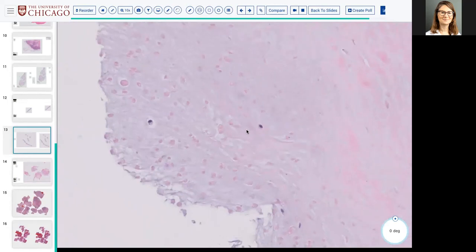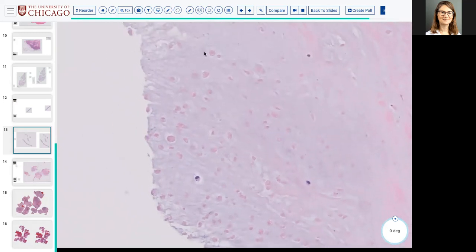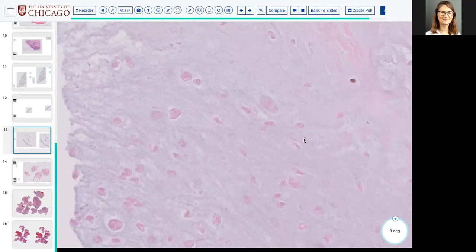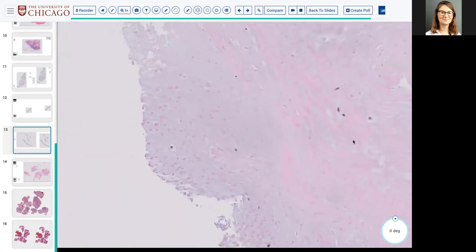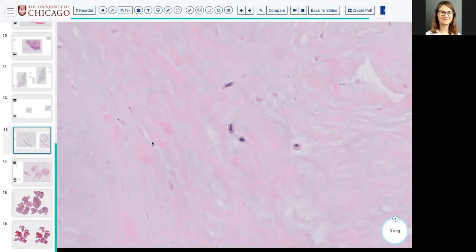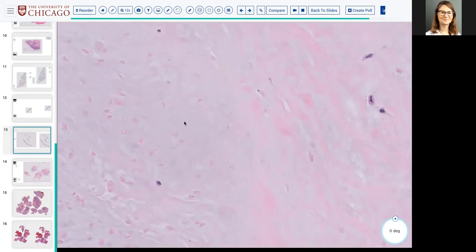Ooh, what's going on here? Do we have some tumor necrosis? Yes, so these pink goobers are basically dead nuclei, exactly. So I'm always careful in lesions with myxoid background or chondroid background to identify necrosis because it can be subtle. So you're basically looking for a slightly darker pink on top of a slightly paler pink, right?